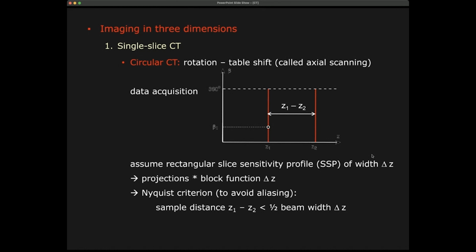We know that that is related to the local distribution of atoms in the object. And we then assume that this atom distribution is related to the anatomy, which obviously it is, but keep in mind that you always take these different steps. What you measure is attenuation. You don't measure anatomy directly.